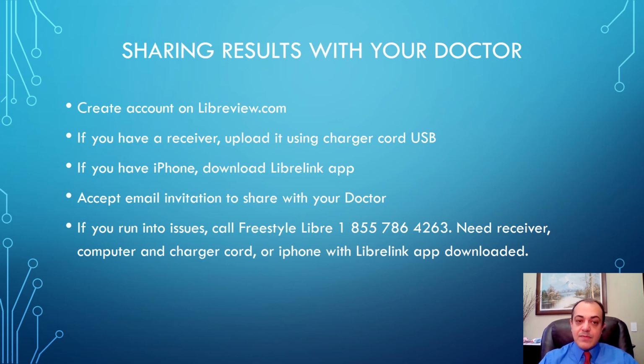You have to accept the email invitation from your doctor's office to share the results. If you run into issues, here's the number that you need to call, but you have to have either the receiver with the charger cord or the iPhone ready when you call so that they can guide you through the steps. Very important to note that if you skip one of those steps, then everything else doesn't work.